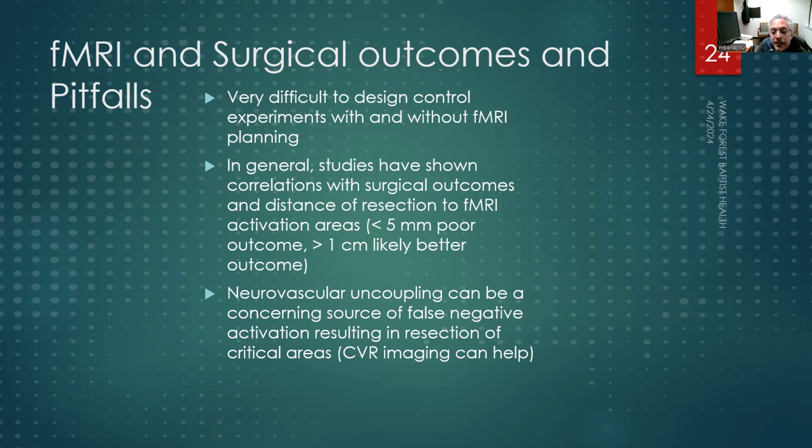But anyway, one thing that can happen is if you have neurovascular uncoupling where that whole biochemical pathway is disrupted, you might have neurons that are responsible for the task at hand, but because they're not causing vasodilation locally because of this uncoupling of the physiologic coupling from the pathology, you won't see it on the fMRI because the fMRI is looking indirectly at neural activation through perfusion.